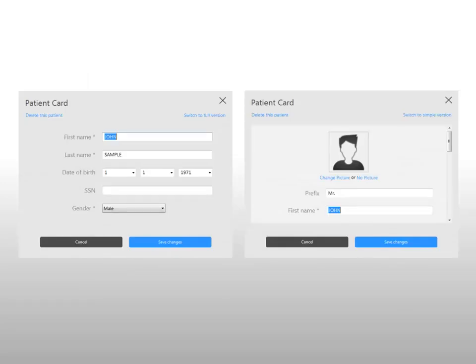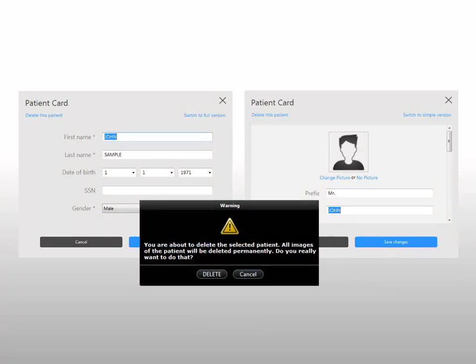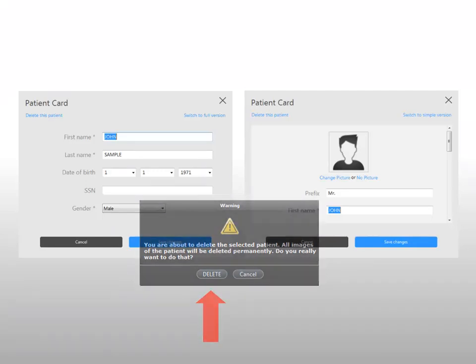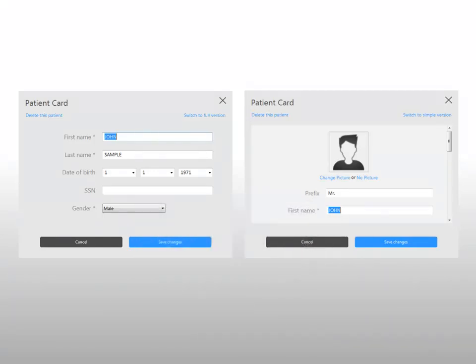To delete a patient card, in the Simple or Full Version Modify Patient Card window, click Delete this patient. A warning is displayed. If you are sure you want to delete the selected patient card, click Delete. The selected patient and all associated images are deleted.